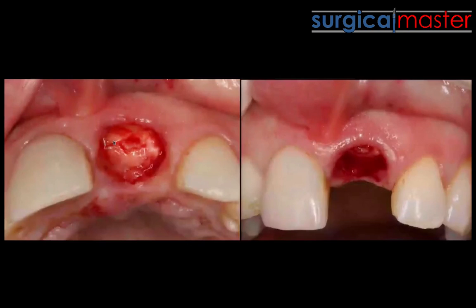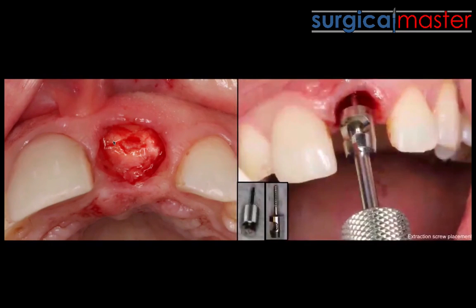So how do you retrieve it? You can reflect the flap, perhaps do a socket shield, start drilling around it and mobilizing it. But really, a very simple way is to use the Ben-X extraction system by inserting an extraction screw into the root, which is basically an anchor.